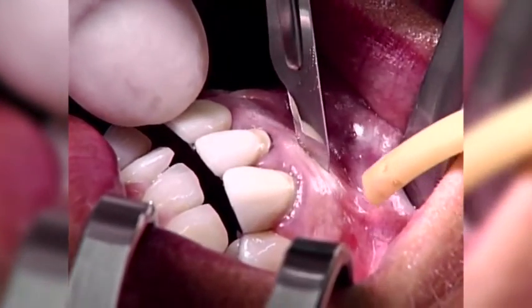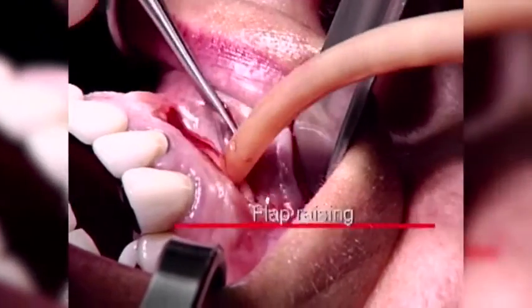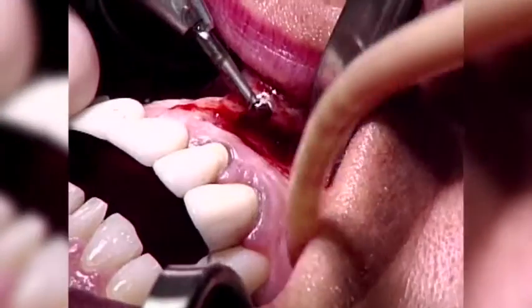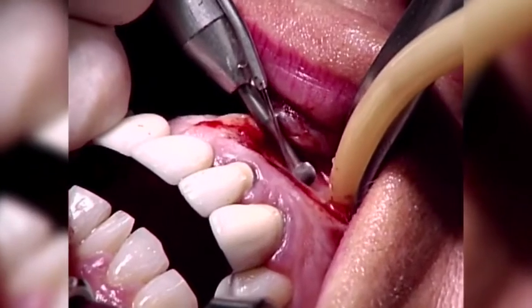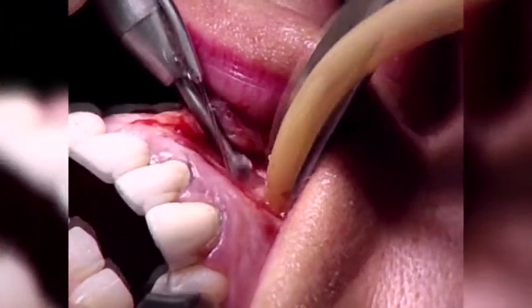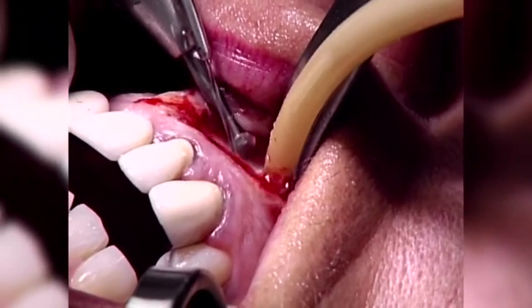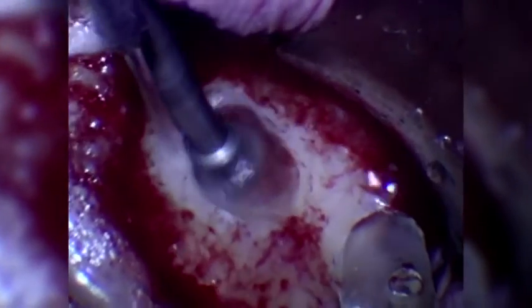To reduce gingival recession of the crown tooth, a semilunar rather than a full mucoperiosteal flap is raised. Removal of the buccal apex of the root tip is achieved with a rosehead burr using continuous coolant irrigation, taking care not to damage the neighboring anatomical structures. Due to the small dimension of the SonicFlex retro tip, the amount of bone removal can be reduced as only a 6 mm diameter axis is effectively required.